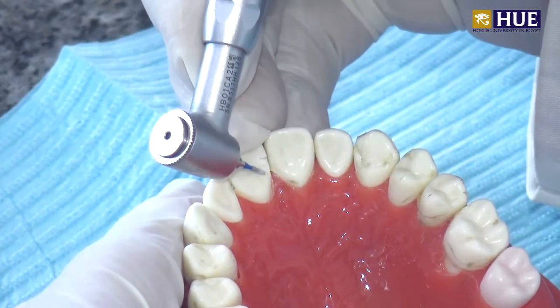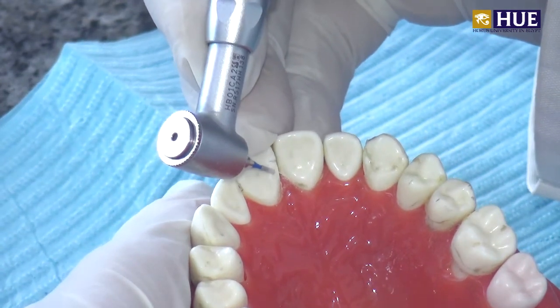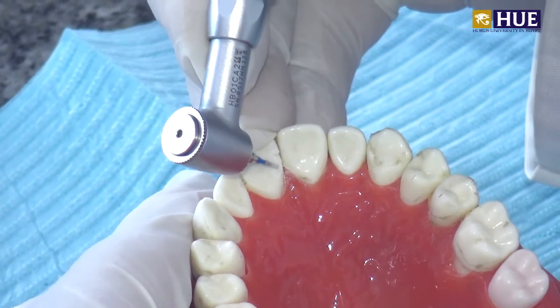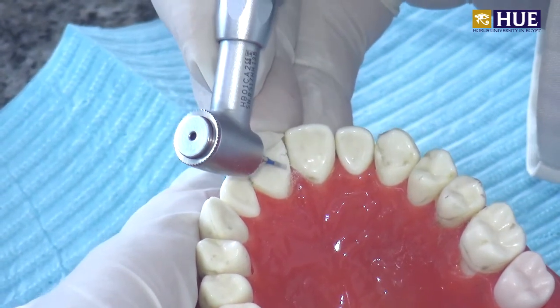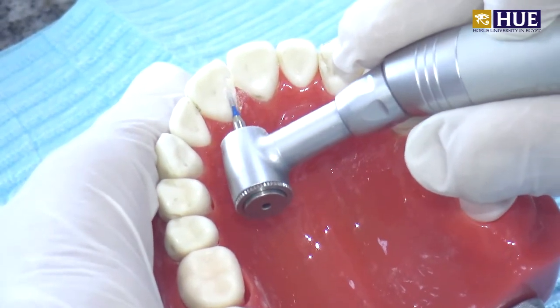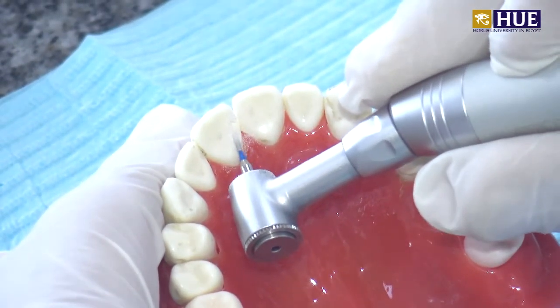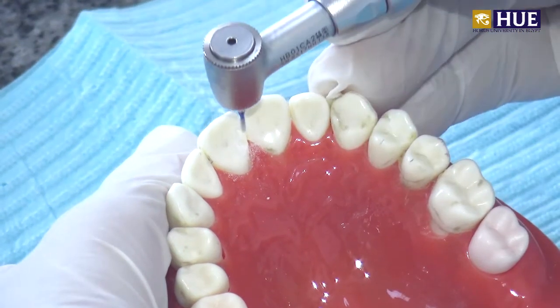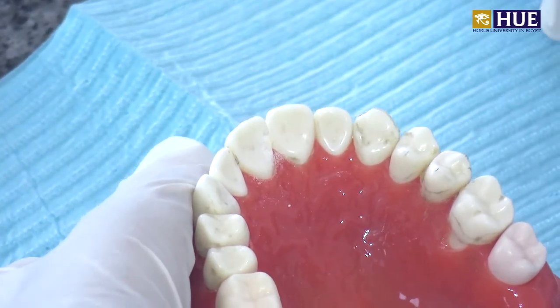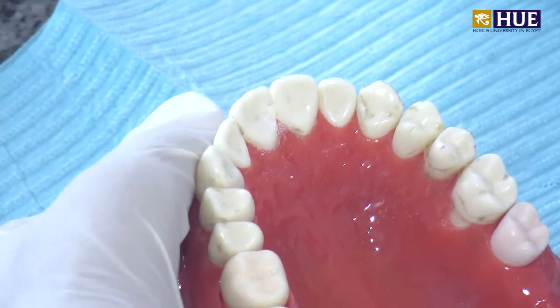Then the palatal margin needs only a short bevel, and the gingival wall like this. As mentioned, this is in a large cavity with the use of composite resin restoration.